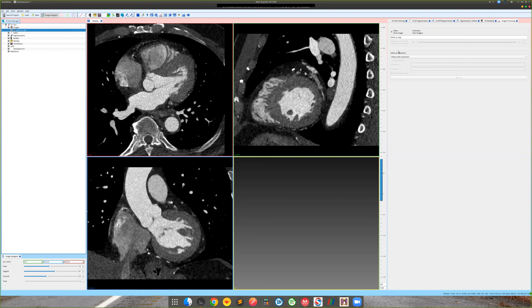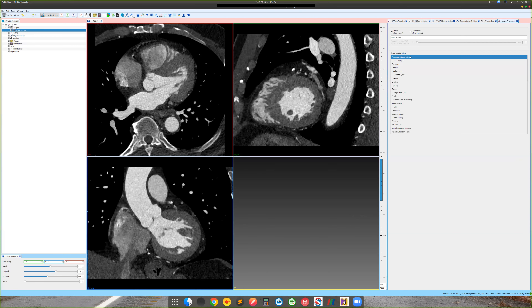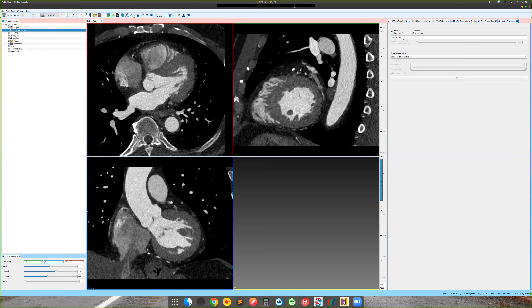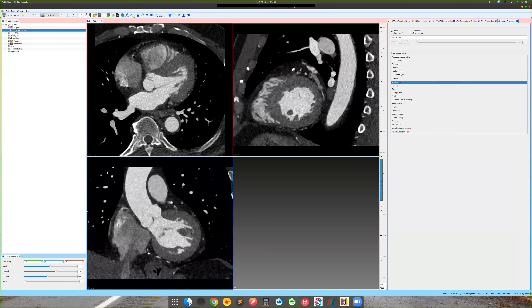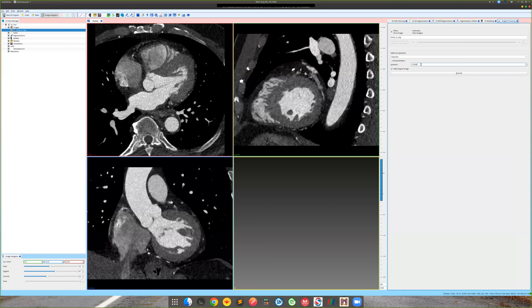Let's say we want to filter this image. There are multiple filter operations — for example, denoising. Make sure the image is selected. You have median filter, TVD, and other morphological operations, but we'll focus on the denoising ones. Let's take the Gaussian filter. What it does is take a bunch of pixels, apply a Gaussian mask, and replace each pixel's intensity with the filtered value. You can adjust the variance — let's start with a value of 1.